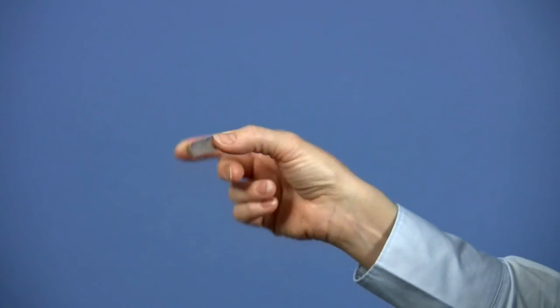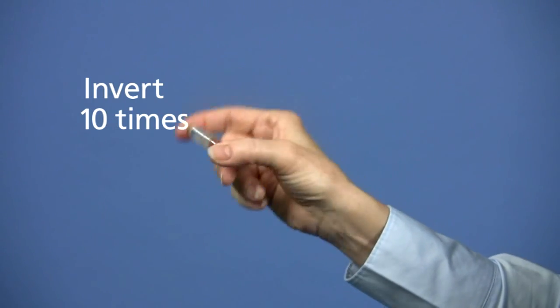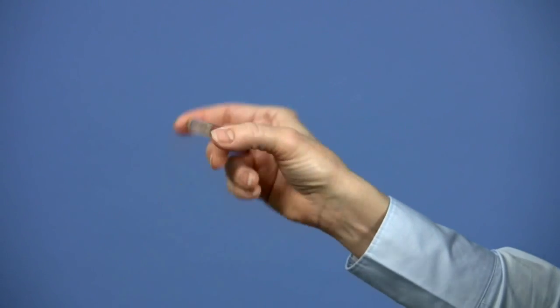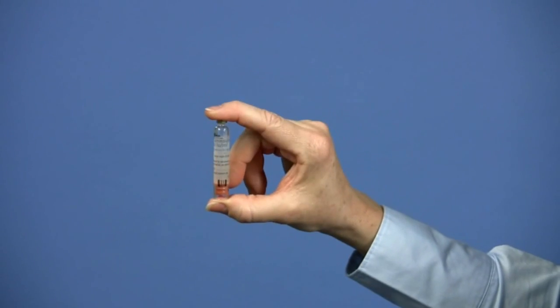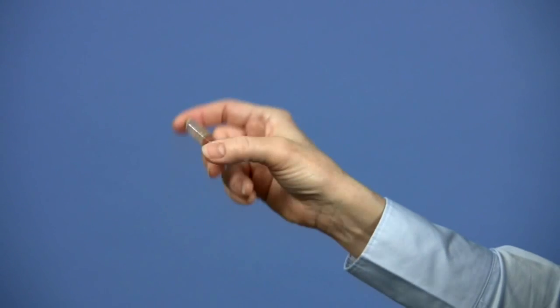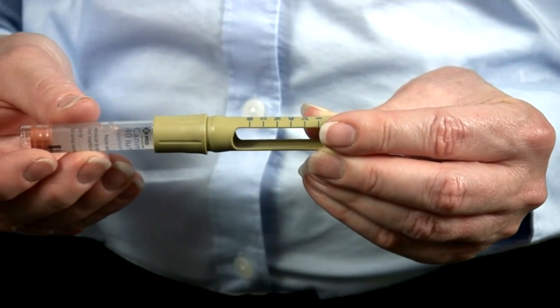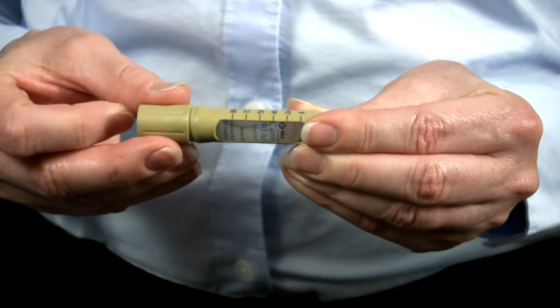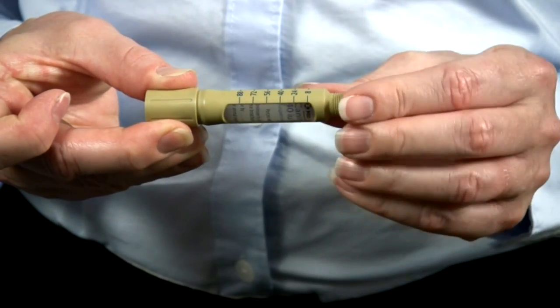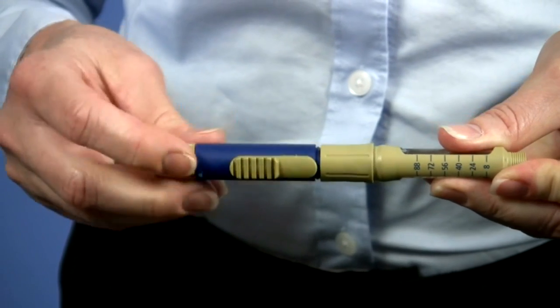Prior to loading a cartridge, invert it at least 10 times until the insulin appears uniformly milky. Only use the cartridge if the insulin is uniformly milky after mixing. Load the cartridge by inserting the metal cap first into the holder. Next, screw the cartridge holder and VetPen body gently but firmly together.